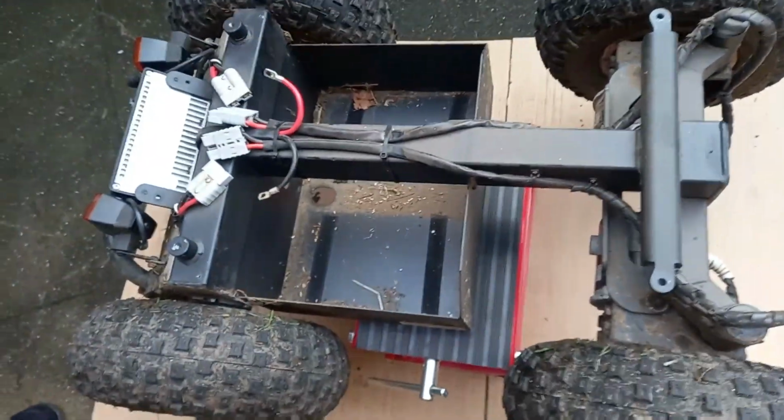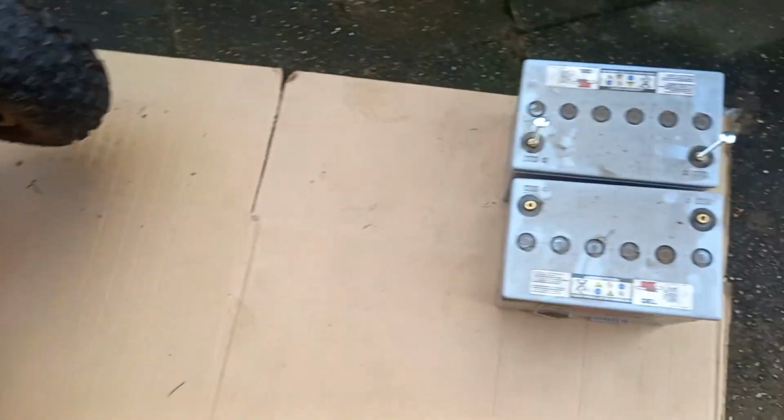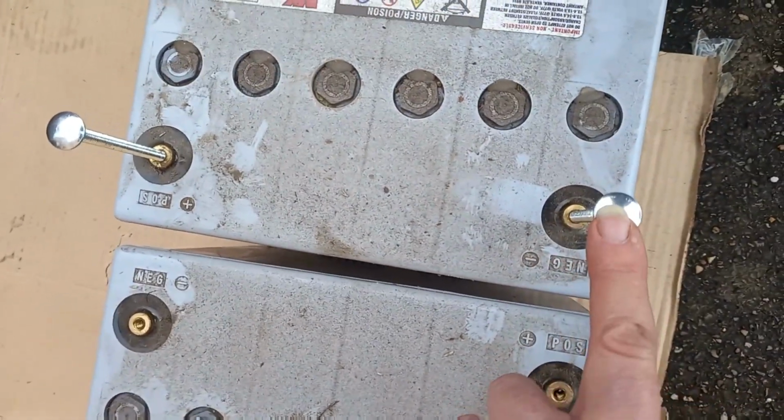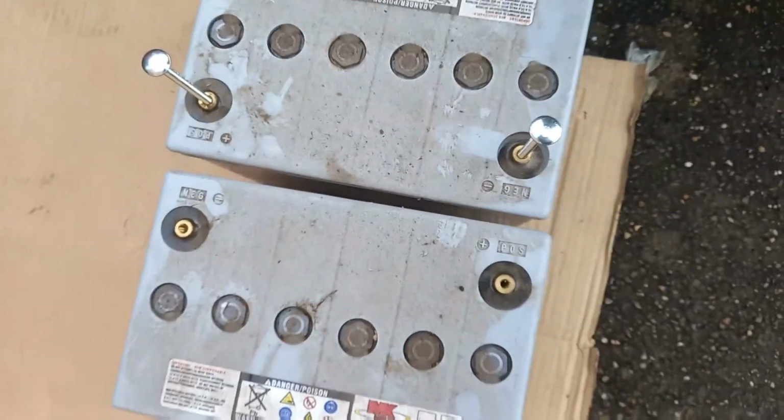Batteries are out. Batteries are very heavy. They're 25 kilograms each. I managed to get one out with my fingers, but this one, John had to put 2 bolts in it so as I could lift it off the bolts to get some leverage on it. But there's another bit of a problem.